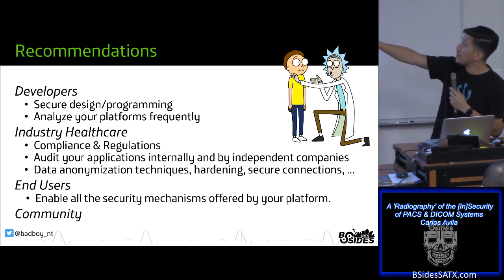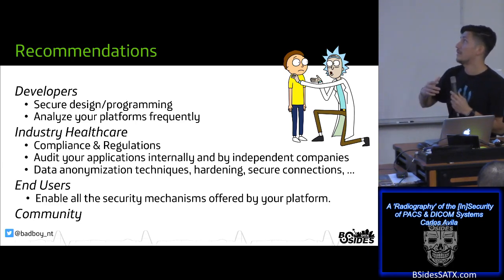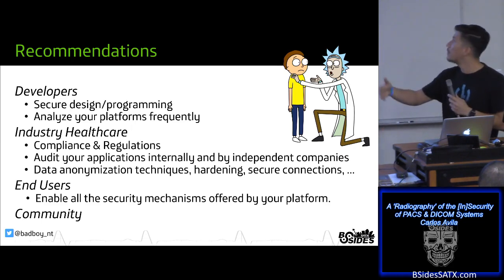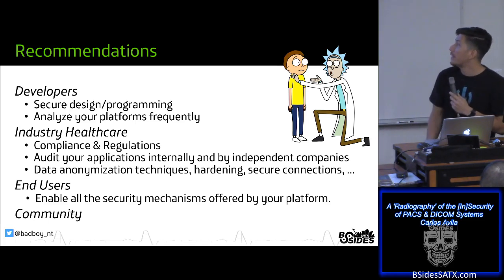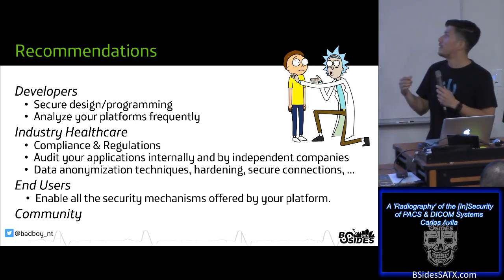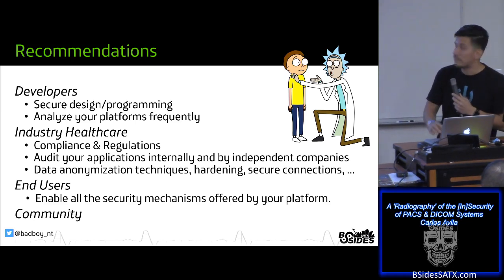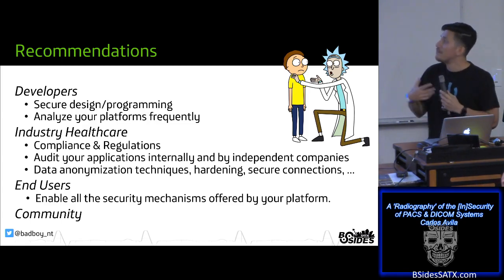You have other techniques, for example, to share information with other healthcare facilities, you can use data anonymization techniques or tools. You have a lot of scripts and tools on the internet for hardening or secure connections, such as DICOM or HL7 over SSL or TLS. End users should enable all security mechanisms offered by the platform, for example, 2FA, login, logout, biometric authentication, depending on the application.